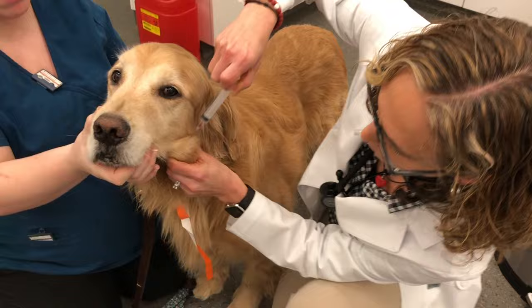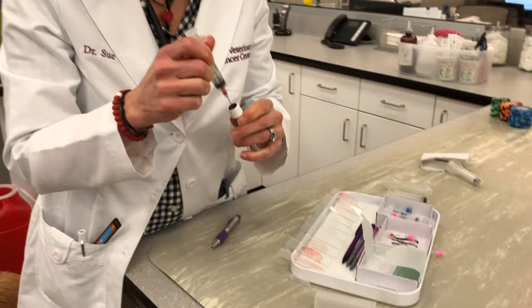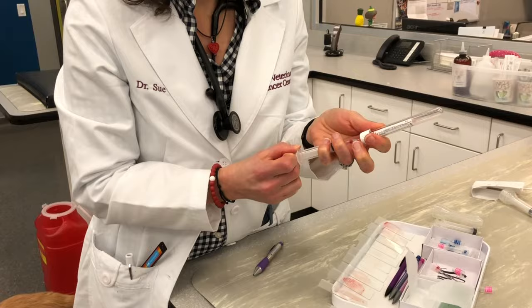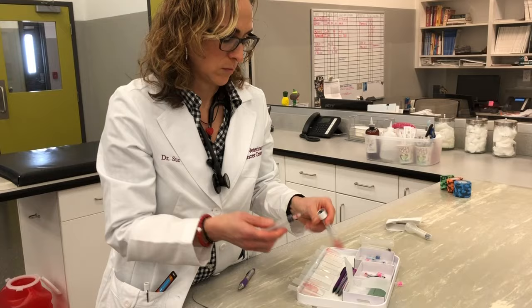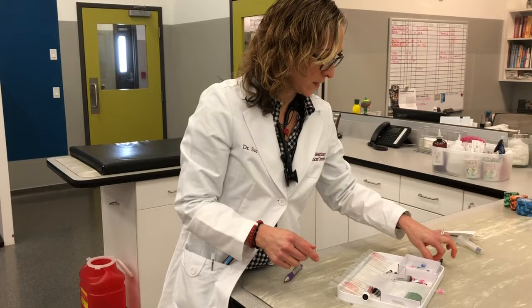Okay, this time you put it in the solution — just a little bit of dog serum and some saline — and then we'll send this off to Colorado. I flush it out a couple of times, nice and gentle, just to make sure we get all the cells. I'll do it one more time just to get more cells, and that's it.